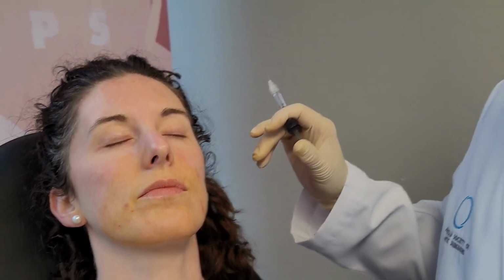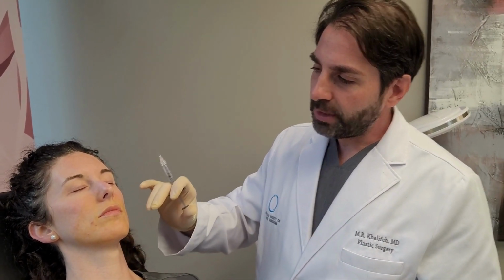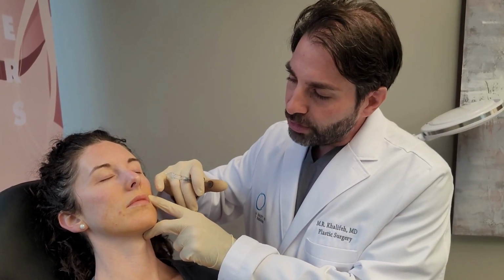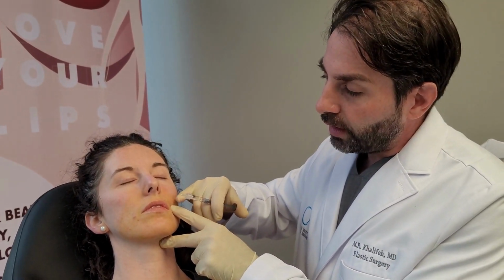When I inject lips, I usually use one of the lip specific fillers, Restylane Kiss or Versa Lips. We're using Versa Lips today, but they're both, in my opinion, very interchangeable, very good fillers. When I inject the lips, I inject with a needle. That's a little bit different than I use a cannula wherever I can, but the lips is an area where you want to be intramuscular and submucosal. And you don't want to get too superficial, and therefore we're going to use the needle.